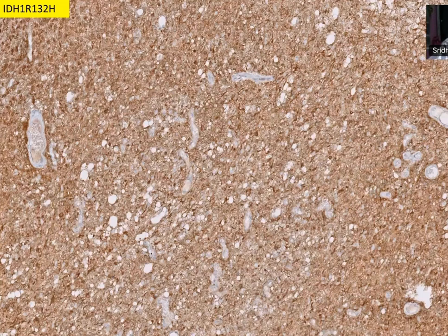If you do IDH1, you will get positive in all cells. That is why it's very important to know this is an IDH1 R132H antibody, a mutant protein antibody. The brown is the dye, diffusely positive. It has worked well because the negative cells expected are negative here, the endothelial cells.